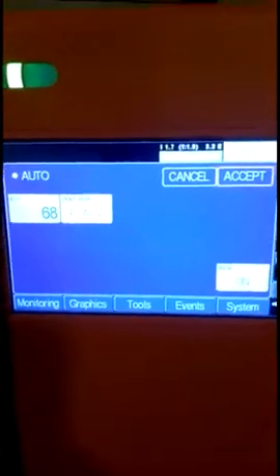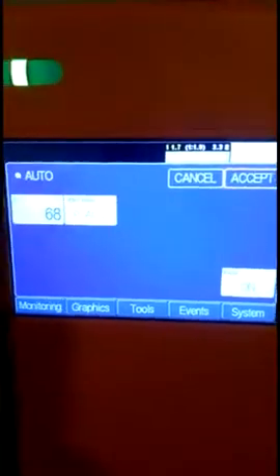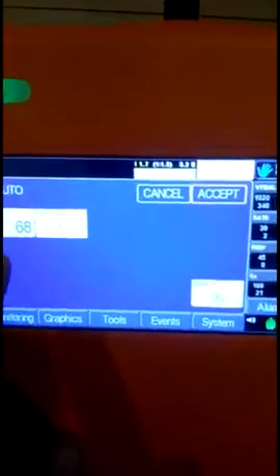To change modes, you select and press this button, and you can change the modes from here.